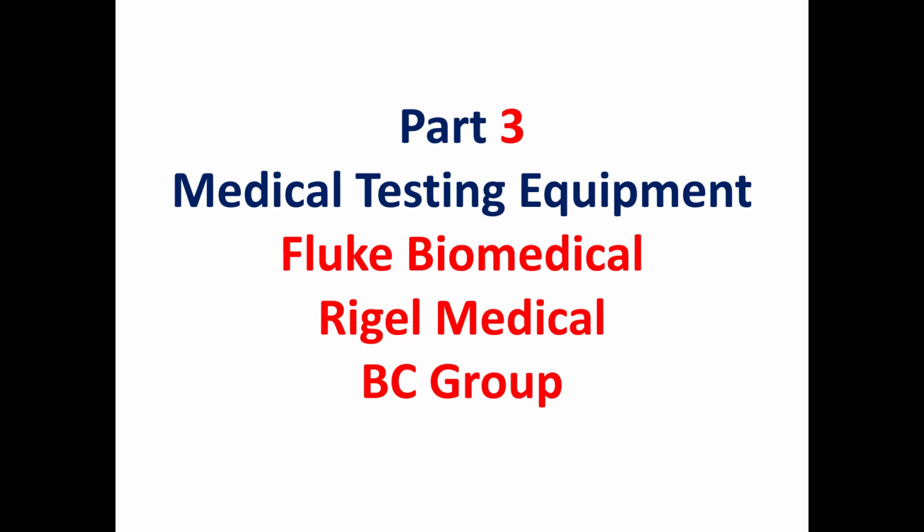Medical testing equipment, or biomedical testing equipment, will be the topic of this video. Medical testing equipment is used to test the electrical safety, performance, and functionality of a medical device or system according to a specific standard such as the IEC 60601-1. This standard has been developed by the IEC, the International Electrotechnical Commission.